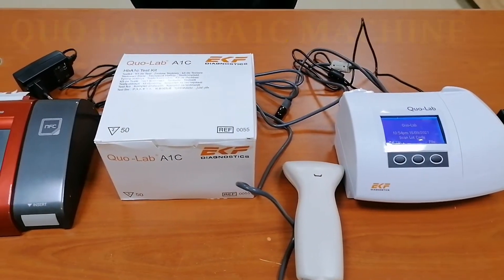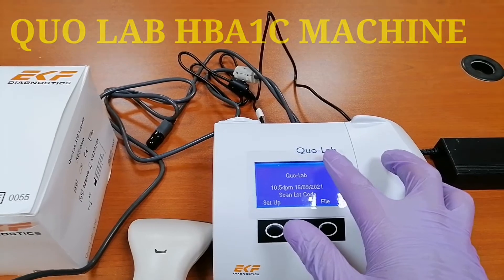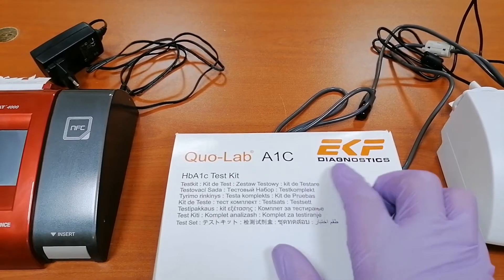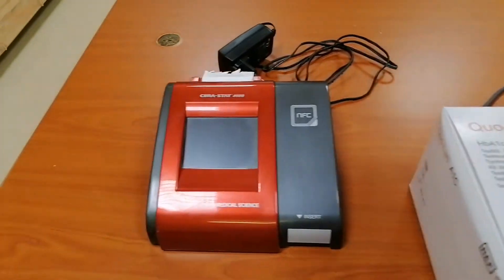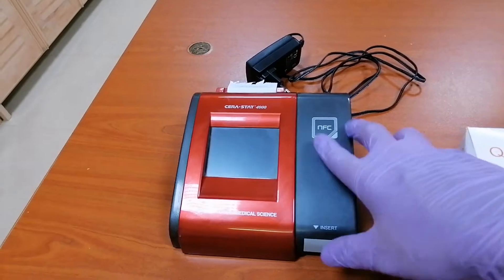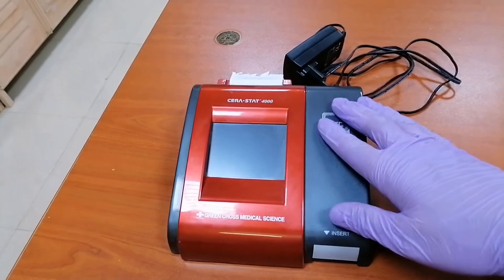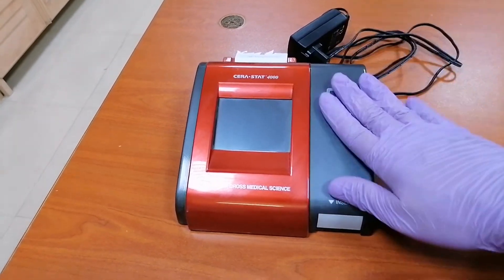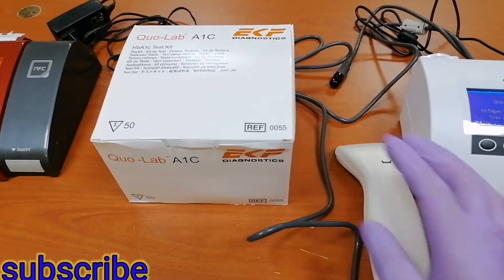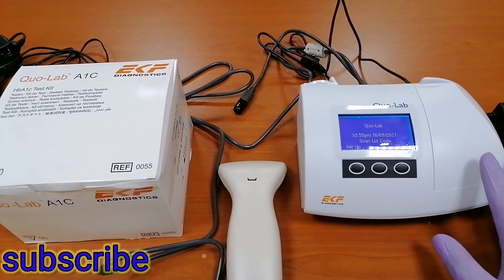So this is the machine — it's called Quo-Lab, from EKF Diagnostics. Before we were using the Cera-Stat 4000 made by Green Cross Medical Science, which is a very good machine. Unfortunately there's a scarcity of reagent, so that machine is not on standby, and they got another machine for HbA1C monitoring — this Quo-Lab.